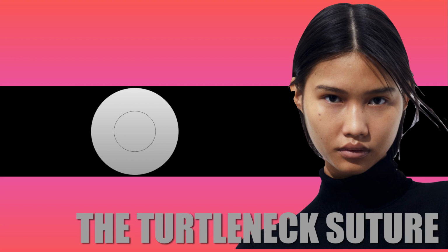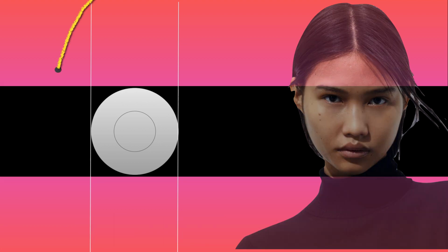This is looking at it from an aerial view, looking straight down onto the two sides of the flap, and then the healing abutment in the center. We first draw this imaginary line right at the tangent of the edges of the healing abutment. Where the suture should be is critical. So here's an example where the suture started outside the healing abutment, taking a bite from one side, going to the opposite side, coming through, and is tied. As this knot is tightened, tissue will pull towards each other, and the tissue will most likely rise and go on top of the healing abutment.